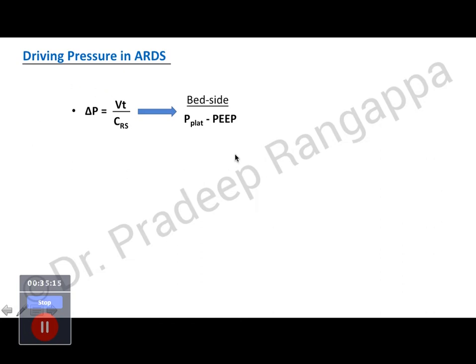On the bedside, simply it is done by you calculate plateau pressure, which is determined by your tidal volume. You lower the tidal volume to lower your plateau pressure minus PEEP. So you have to keep the driving pressure as low as possible. So 15 is the ballpark. So try to get the driving pressure down by optimizing either low tidal volume or increasing the PEEP.